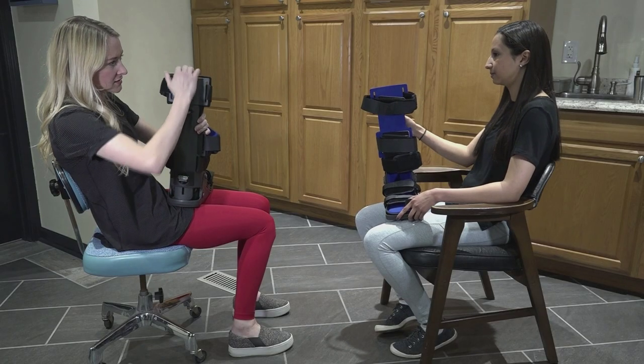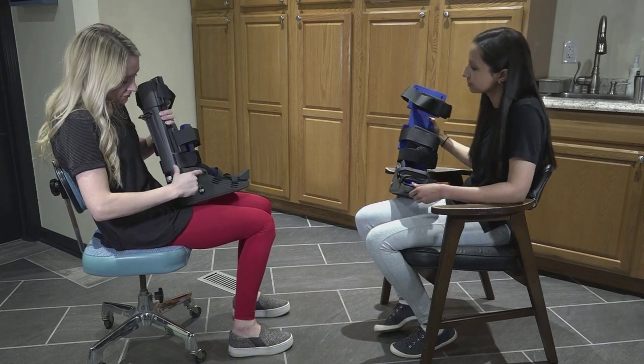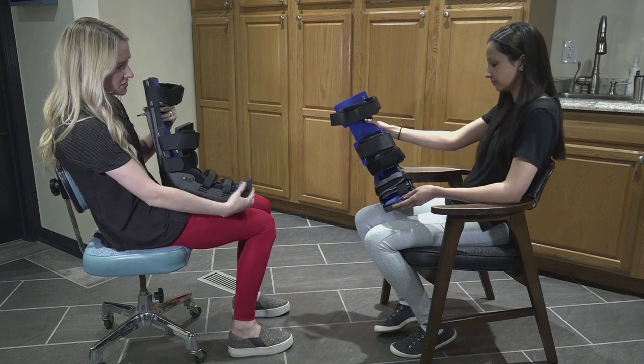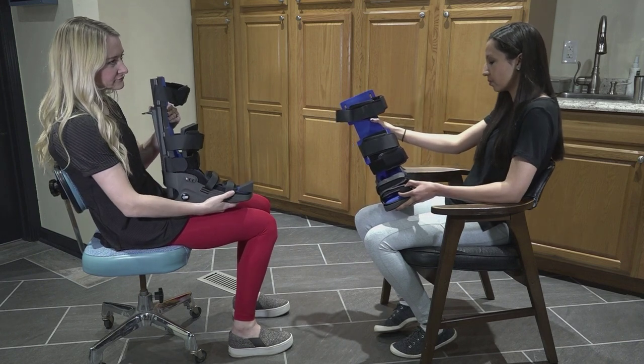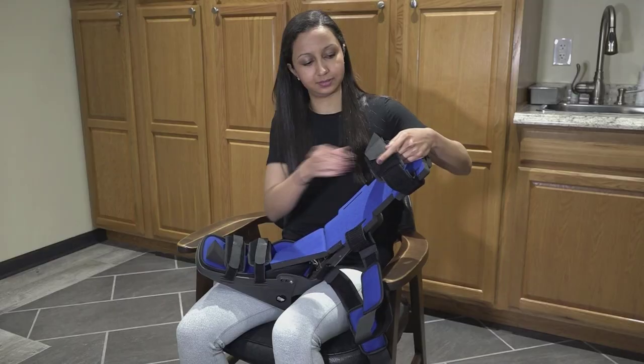When dispensing the Aquinas brace, it is important to educate the patient on how to properly don and doff the device. This will result in better compliance, a better stretch, and better results. We recommend showing the patient how to use the brace by having them mirror each step.